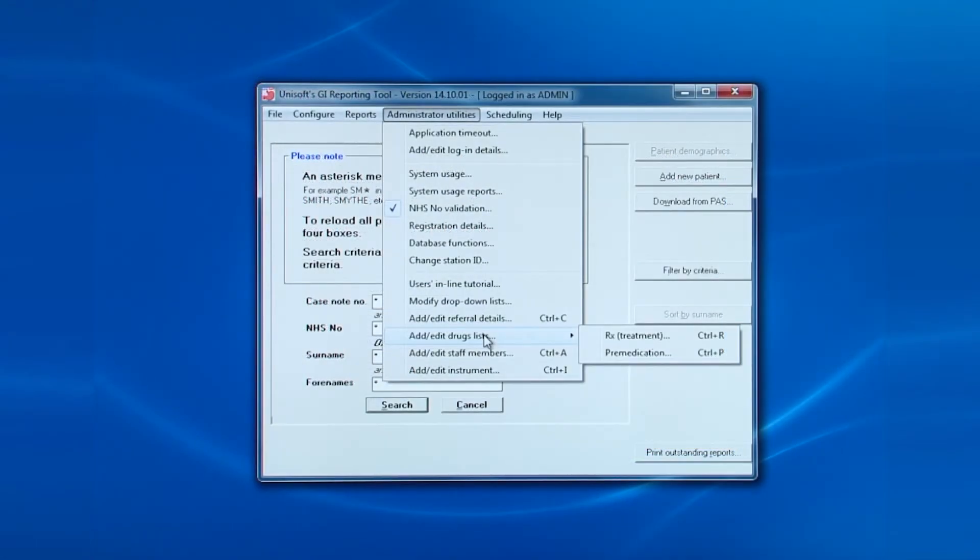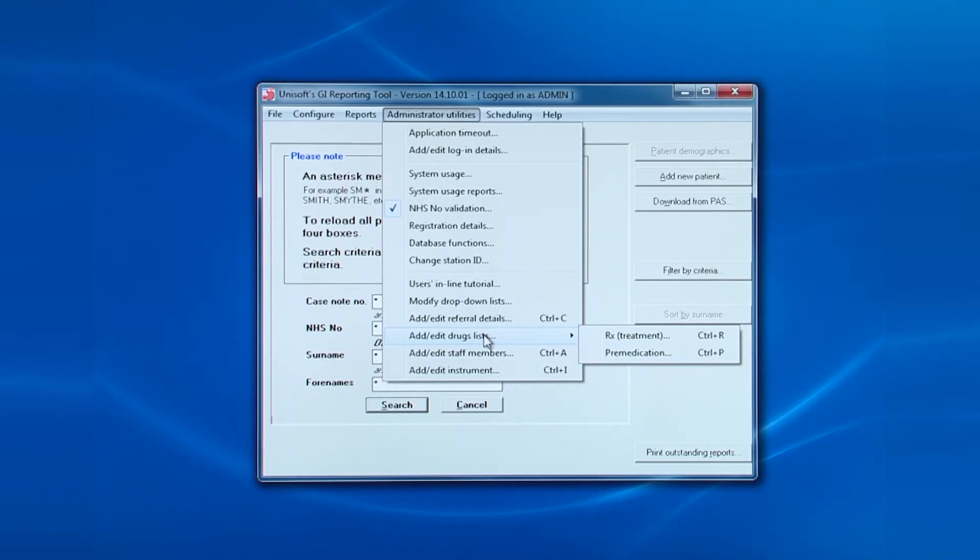This is to do with maintaining the list of drugs. We differentiate between drugs prescribed for treatment and those used by the endoscopist during the procedure. Both lists work in the same way, so we'll choose the pre-meds.